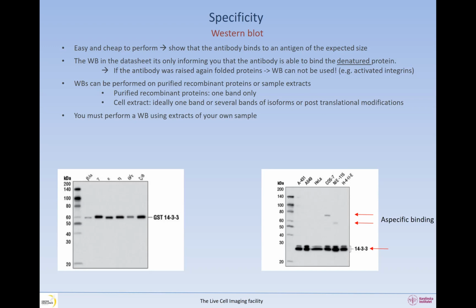It can also happen to be vice versa, that you have some data from tissue extracts, but you are working with cells. Then you can actually do something about it. You take your cells, you pellet them, and you handle that pellet like it is a piece of tissue. So you will freeze them or paraffin embed them if you want, and then you will cut and perform all the steps exactly like it was a tissue, and you will see what results you get.